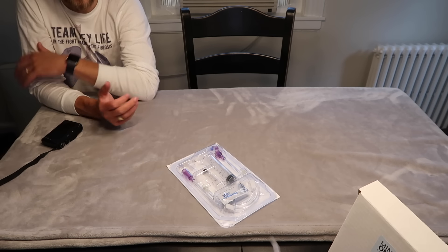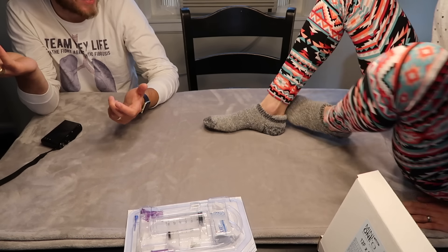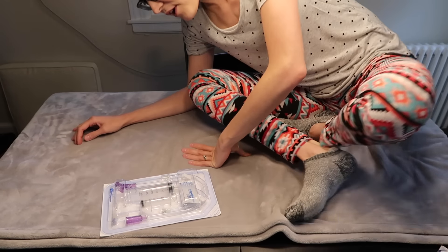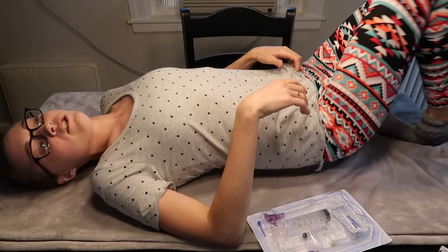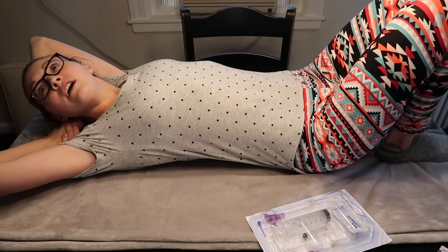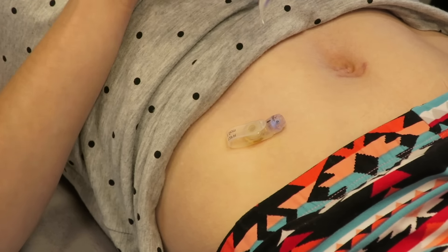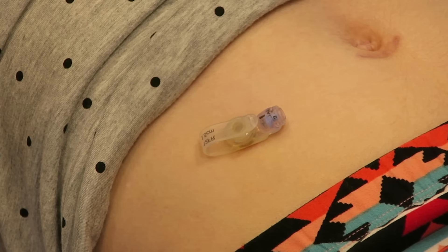Just washed my hands. I'm gonna put some gloves on once I lay down. Mary's gonna do this — she's able because it's kind of just a simple procedure. I use the AMT Mini 1 balloon button. Mine is a 12 French 1.5 centimeter balloon button. Maybe I should wait till my blood sugar comes up — yeah, that's probably a good idea.